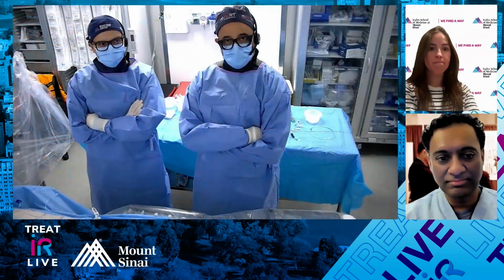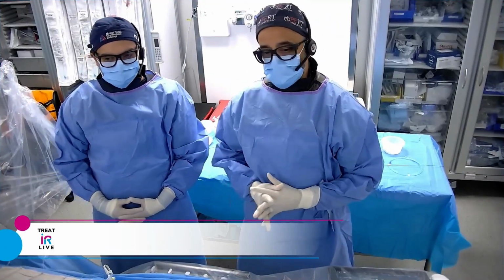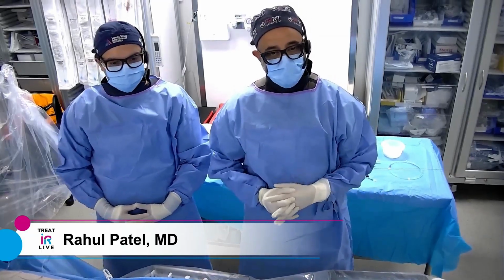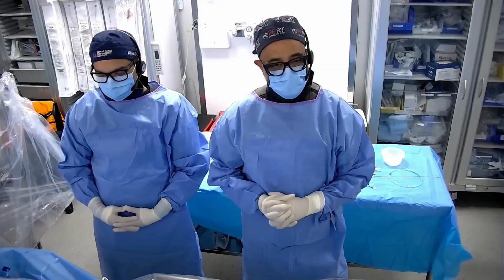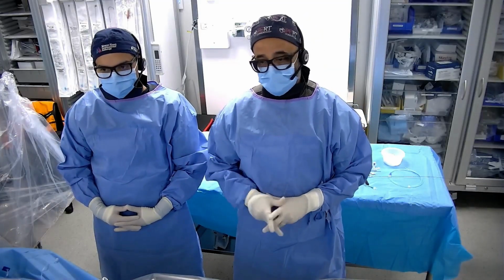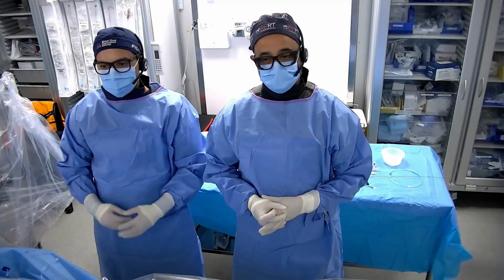So without further ado, let's get to the lab with Dr. Patel. Again, my name is Dr. Rahul Patel. I'm one of the interventional radiologists here. To my right is Dr. Ishan Sinha, who's one of our PGY6 IR/DR residents. I'd like to thank our partners, Broadmade AV, our wonderful nurses and techs, the patient for allowing us to share his case, and our anesthesia services for helping make these cases go smoothly. I'm going to ask Ishan to introduce the case, and then we'll get going.